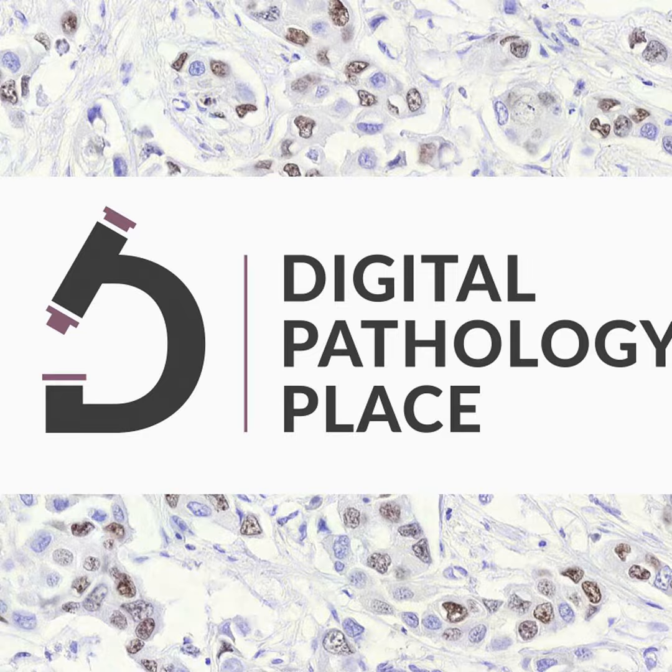So the second reason they missed it was, I would just say, atypical examples. We all take histology. We learn these beautiful prototypical examples of a feature. The one that we highlight in the paper is called asteroid bodies. These are features of granulomatous and other types of inflammation. They basically look like big red starfish or octopuses. They have long stringy arms and a nice red center. They don't really look like asteroids.